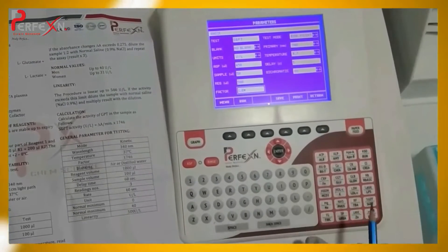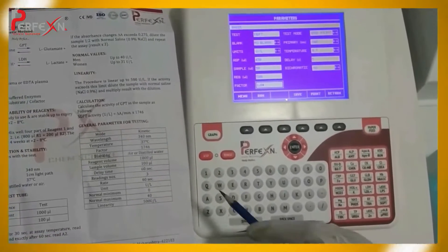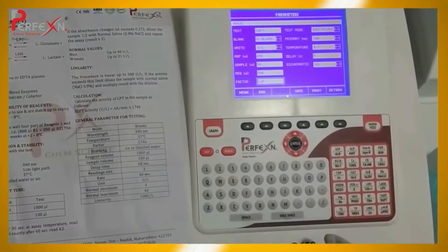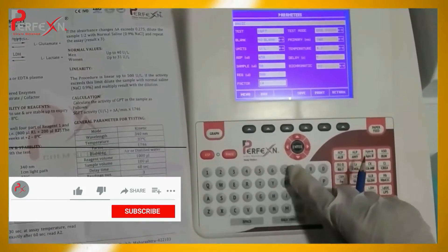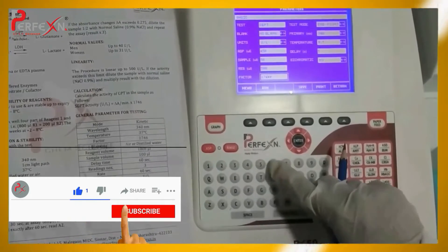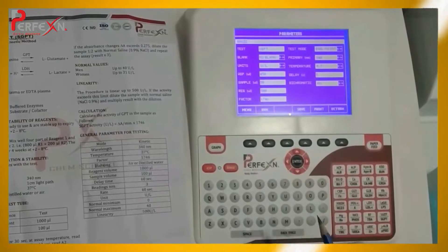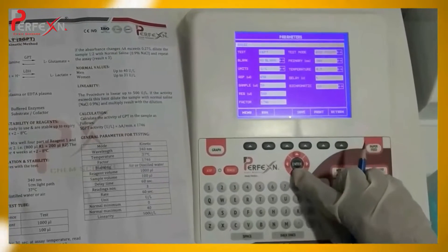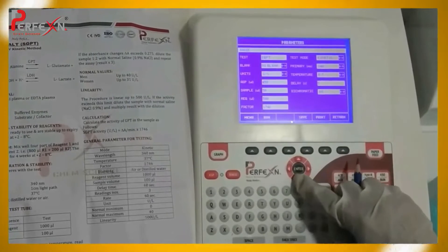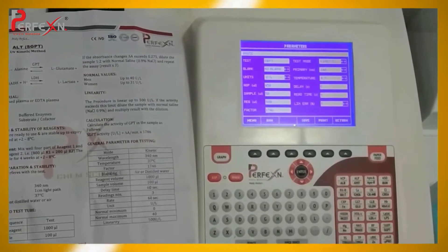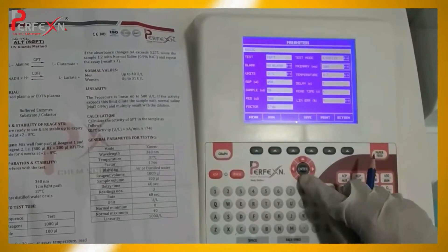Now continue to the factor. On the literature, you will see the manufacturer has given the factor as 1746, so enter 1746. Enter the test mode — as this is the kinetic method, enter the kinetic mode. For the wavelength, the manufacturer has given 340 nanometres, so enter 340 nanometres.